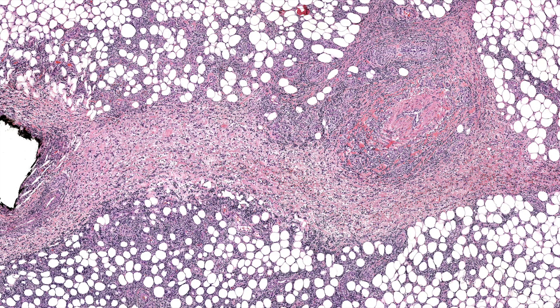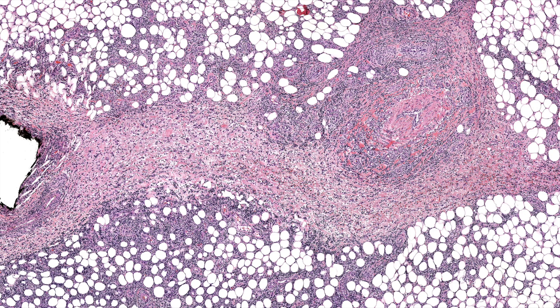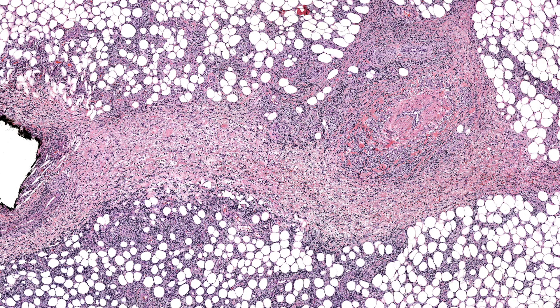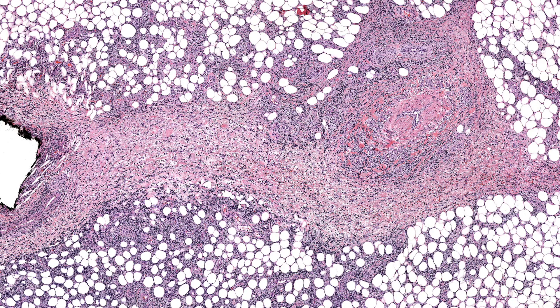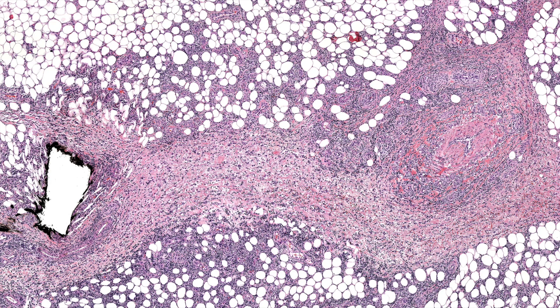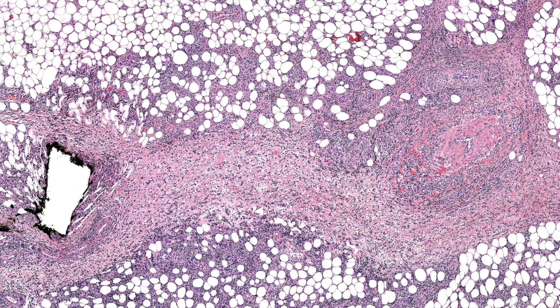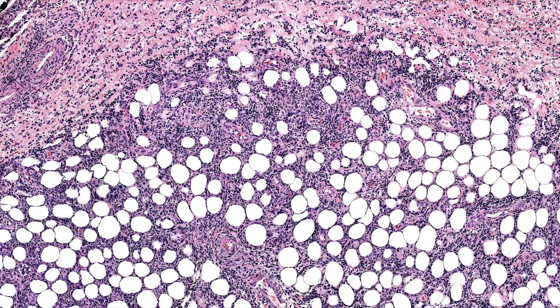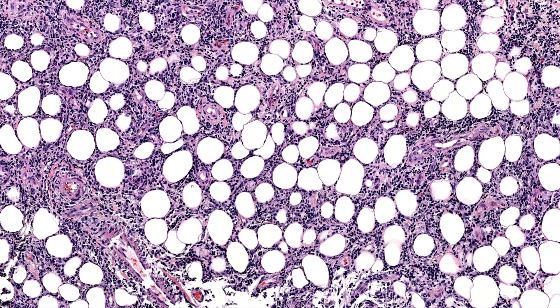Morphology-wise, the things that help me sort this out from lupus paniculitis — although in real life I certainly struggle with this, and I usually will show my colleague Dr. Junkins Hopkins, who's much more knowledgeable about hematopathology of the skin. But things I find helpful: if I see more fat necrosis with really bright pink-red fibrin and hemorrhage, fibrinoid necrosis wiping out the lobules of fat, I think of lupus paniculitis more. If I see lymphoid aggregates with germinal center formation, or if we have the dermis and features of lupus there, that also makes me think of lupus paniculitis. Although people with lupus can also get the T-cell lymphoma. And then if I see more atypia and obvious rimming of the fat cells, I think more of paniculitic T-cell lymphoma.